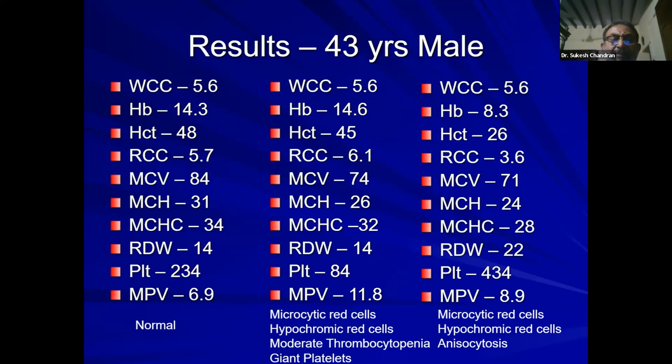This one is basically most likely a person from the eastern part of India who has HbE. That's why he's got low MCV and normal RDW, and he must be having macrothrombocytopenia, which is very common in the eastern part of India. At least 30% of patients coming to Vellore are these types. Then the last patient is nothing but iron deficiency anemia. What extra information are we going to add by looking at the smear? Pencil cell, target cell. Anyway, the information from these definitive flags is very clear.